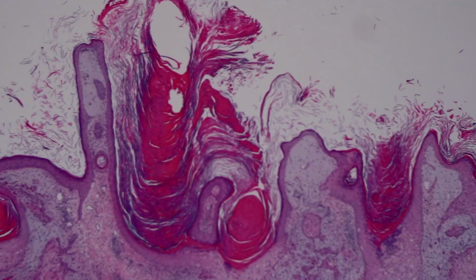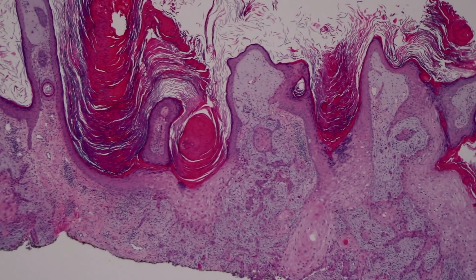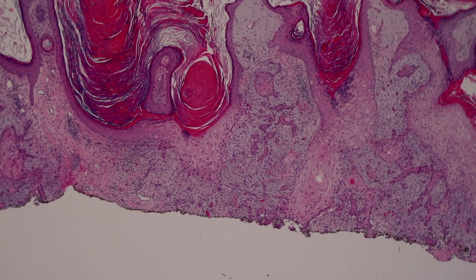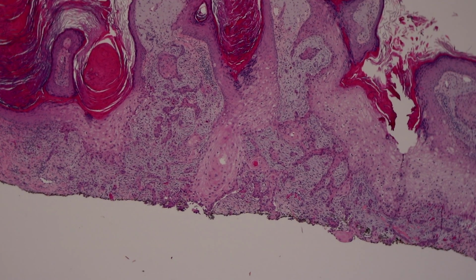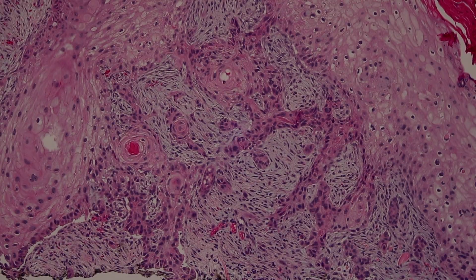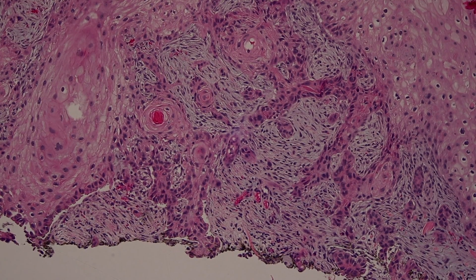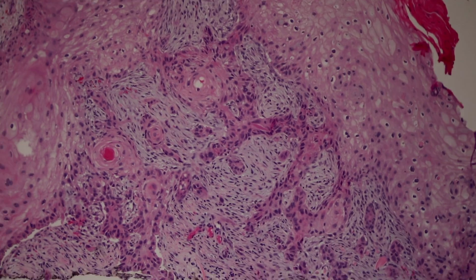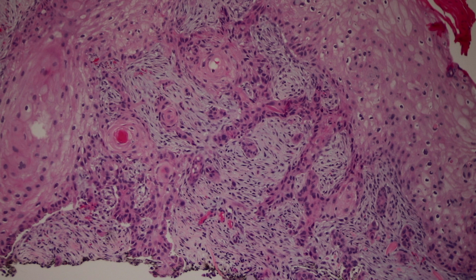And here's a squamous cell carcinoma, again, with kind of a little bit of a warty look on the surface, and underneath, very infiltrative growth. I like to mention when I see really striking infiltration, little cords and strands and tiny nests of tumor invading down with a real dense fibrotic stroma, similar to the pattern that you see in infiltrative or more morpheaform basal cell carcinomas. I feel like sometimes we see a similar growth pattern in squamous cell carcinomas.